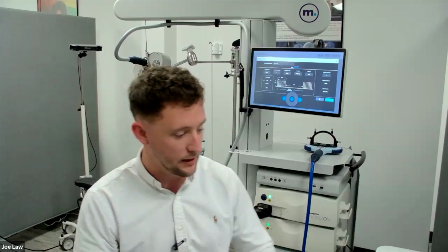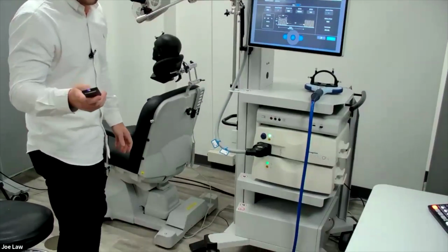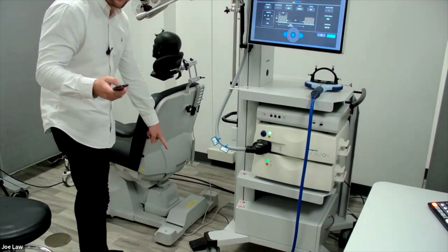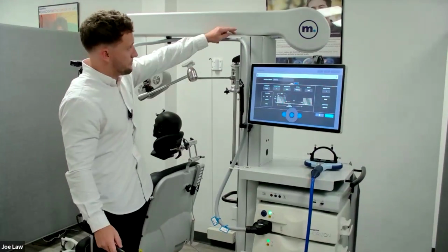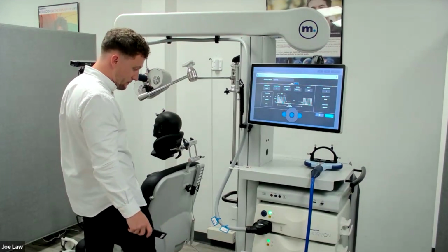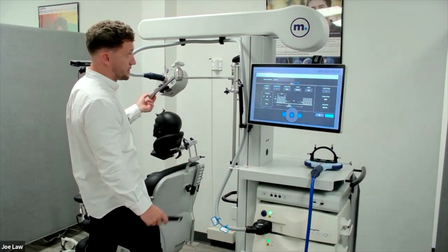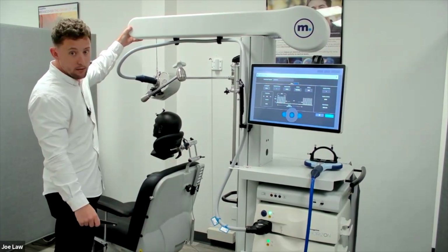Great. How is the mast released in order for you to rotate it? Are you holding something? Yeah, apologies. I don't think the camera's picking that up. But if I try to do this, you can see here that there's a footrest on the floor. When I press that footrest, there is a magnetic brake in this mast here. Once I press it, it unlocks the boom. Once I let it go, it's now locked. So this will no longer move.